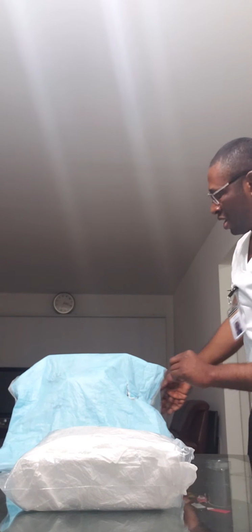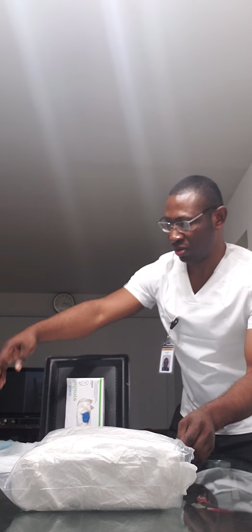All right. Okay, so I provide privacy, do my hand hygiene, wear my gloves, raise the bed up, and remove the handrail, okay? And do you want me to open this? Okay, thank you. All right. Change the pad.